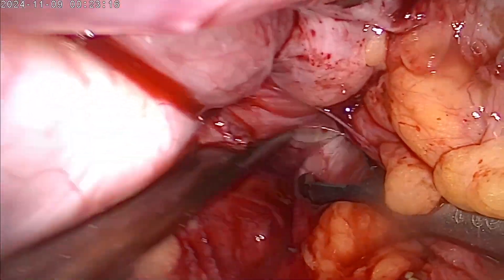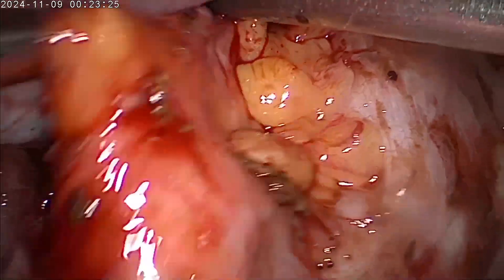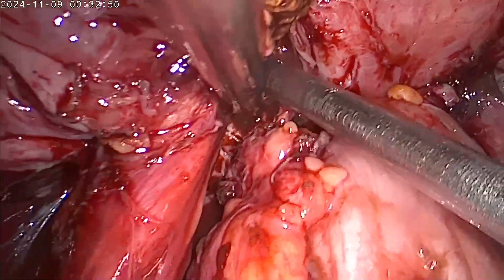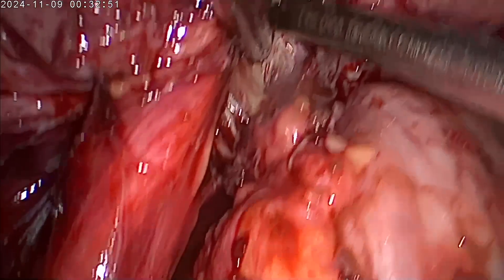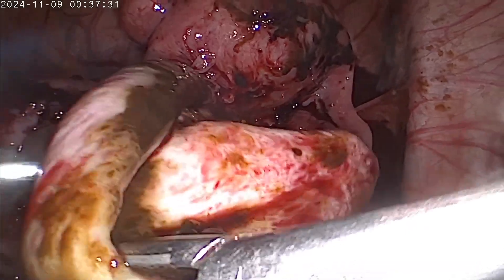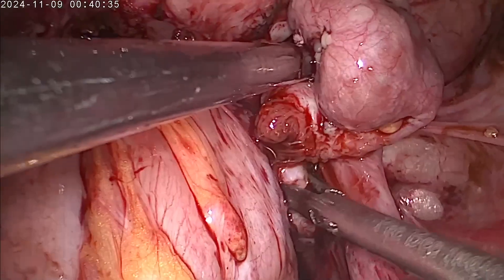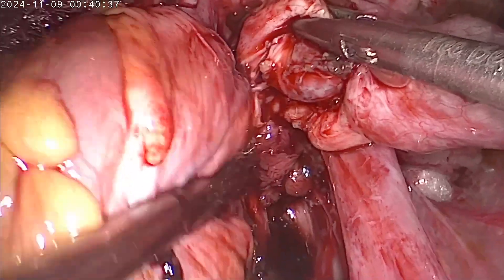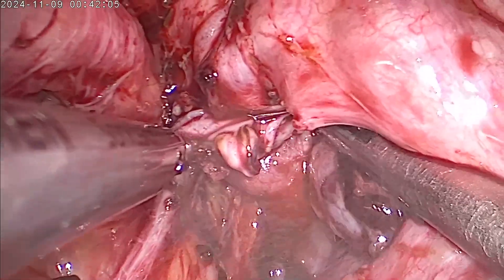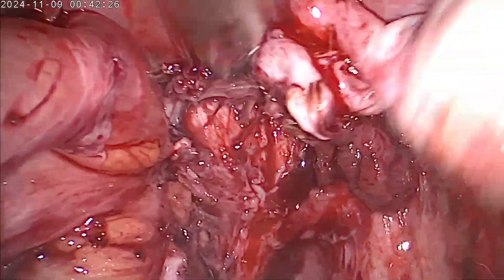We then identify the IP ligament on the left side and we separate the ovary from its adhesions within the POD. We now hitch the left ovary towards the abdominal wall to give better visualization of the pouch of Douglas, and we free up the right side ovary as well from its attachment and hitch it to the abdominal wall.